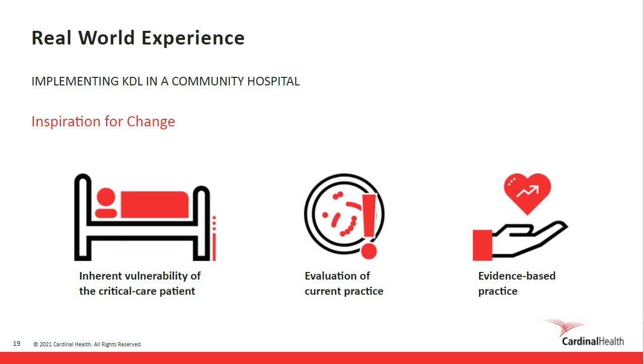We also took a look at the anatomical positioning of the lead wires. They are positioned on the anterior chest and trunk. Although my hospital does not perform cardiothoracic surgery, the ECG leads and lead wires are in close proximity to other incisions and medical devices such as chest tubes, central lines, new pacemakers, portacaths, G-tubes, or hemodialysis catheters. There is an undeniable risk for cross-contamination between the device and the patient.